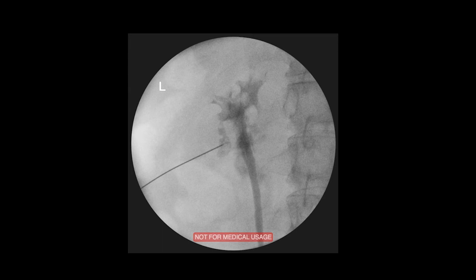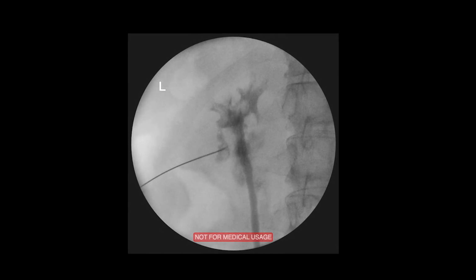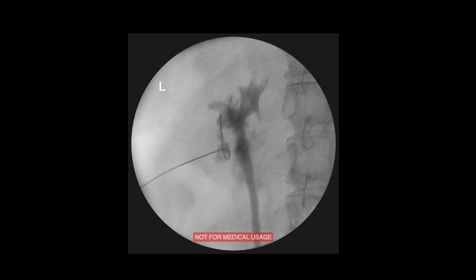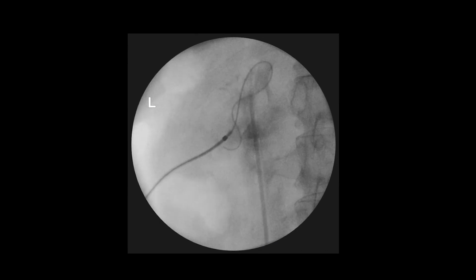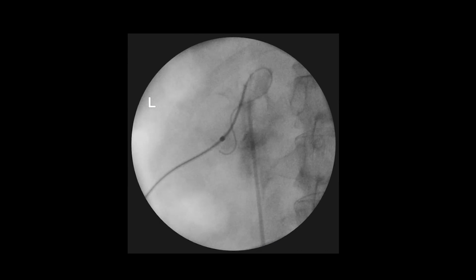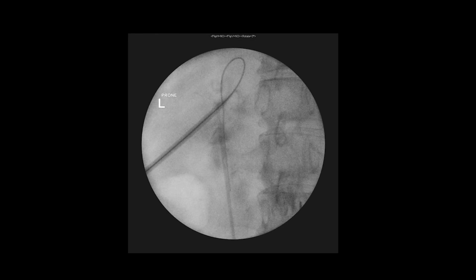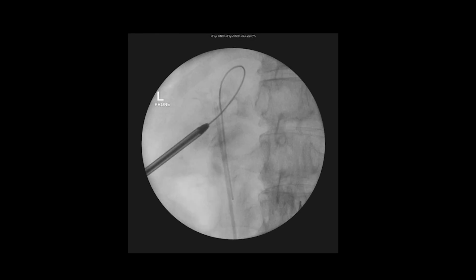You can see here that we've got needle access to our diverticulum, and we're then going to pass a wire, and we're going to dilate over into that. And then once we've done that, we can then pass our 13 French ultra mini kit over our access and then into the collecting system. So there we're just going in with our catheter. We've got access then through the top of the diverticulum, so you can think we're widening the neck of the diverticulum a bit there. And then you can see we've gone in with our ultra mini PCNL kit to access the diverticulum.